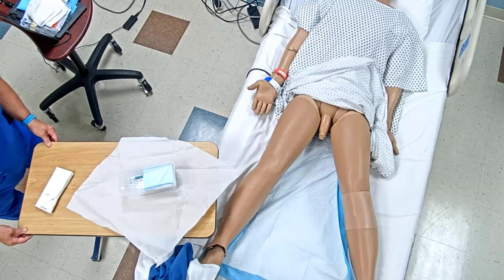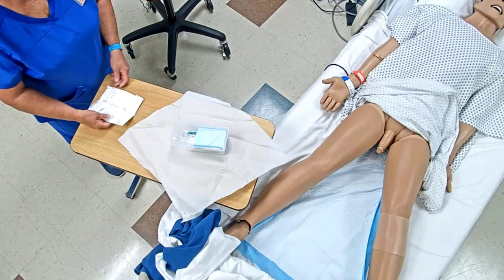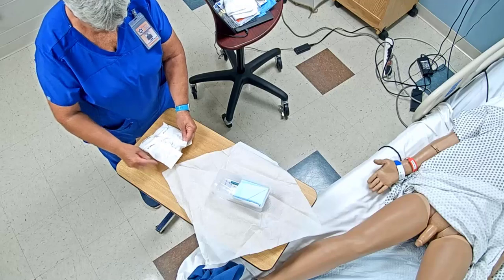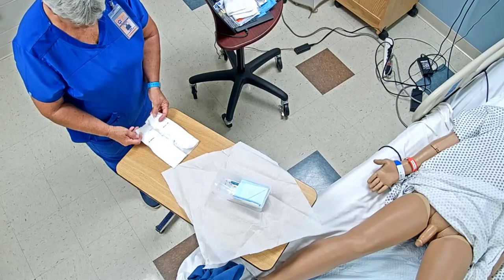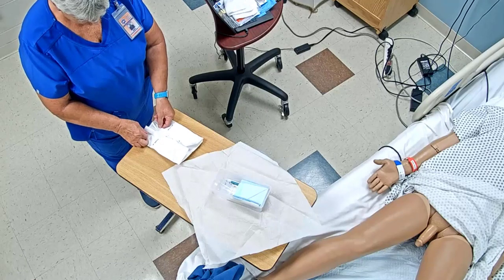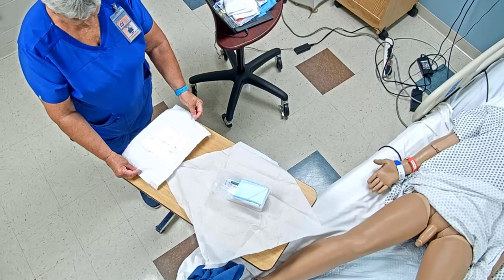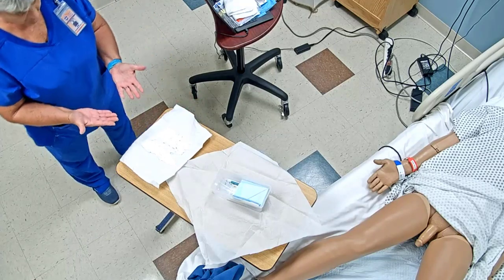Now as I step back over here, I want to make sure that I keep my sterile field in my line of vision at all times. So with these gloves, it tells you right here it says the thumb is out, okay? So I'm just using my finger underneath there to kind of help. And when I open this up, it'll stay open. You want to make sure that that package doesn't fold back on itself, okay? And your gloves should be in there like this.